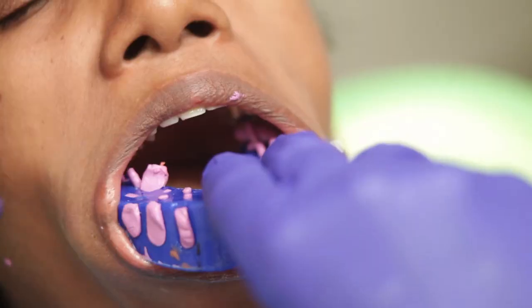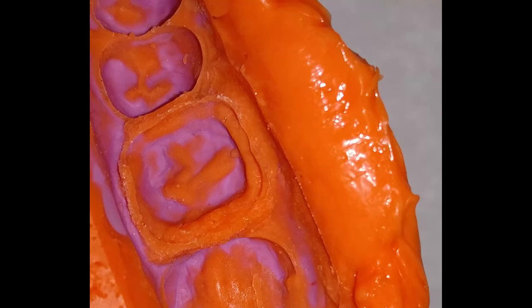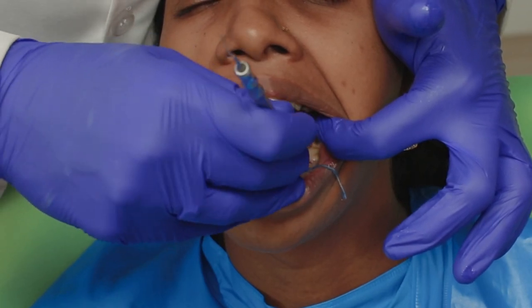My impression is ready and this is how it looks. You can appreciate the light body going beyond the margin. Now it's time to take the two-step impression.